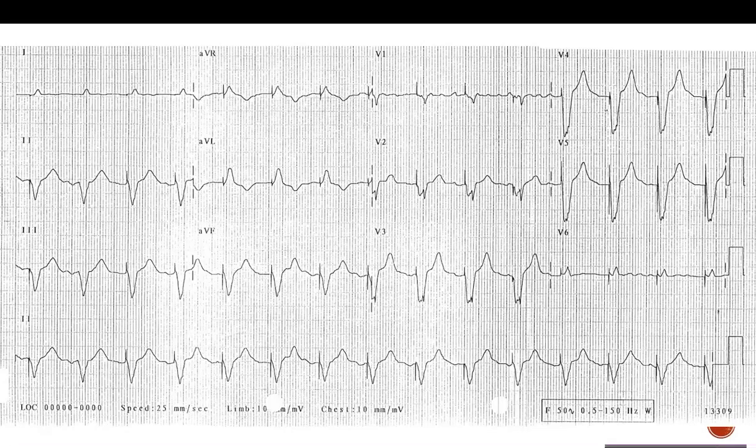Third, you don't see any intrinsic QRS. All we see is a paced ventricular rhythm. Based on that, the pacemaker seems to be functioning normally in terms of pacing, but you can't assess the sensing of the pacemaker. You're not sure if it's functioning as a single chamber or dual. So I would say this might be atrial fibrillation with paced ventricular rhythm, normal capturing, can't assess the sensing, and most likely a single chamber pacemaker. When you explain this to someone, you've got all the points together.